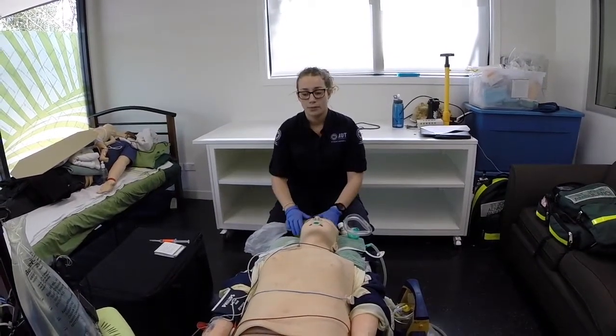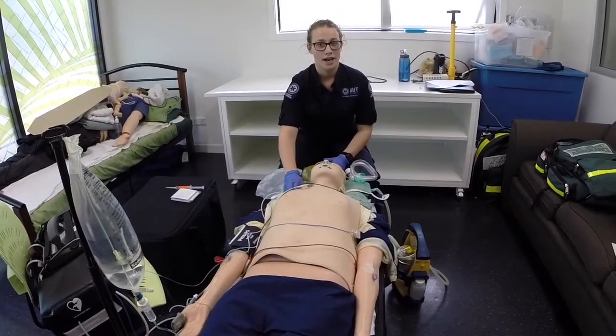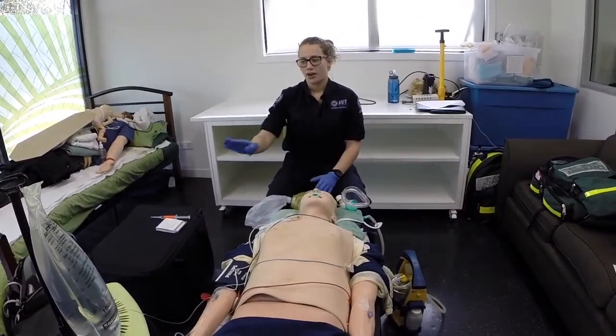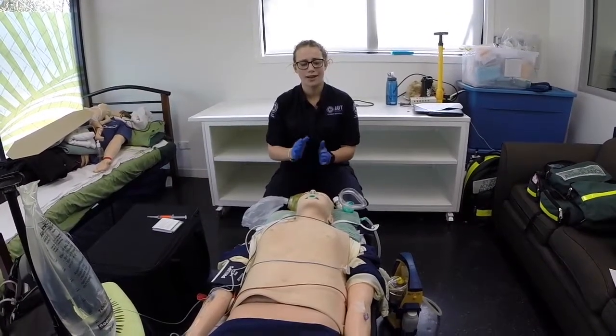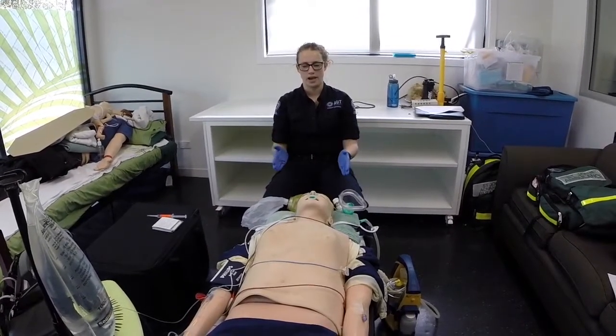We've got the monitor attached by the NIBP, the ECG 12 lead, as well as SpO2. And this is going to be set on the monitor to monitor the vital signs every 5 minutes. We've got large bore IV access in both ACFs of the patient's arms.